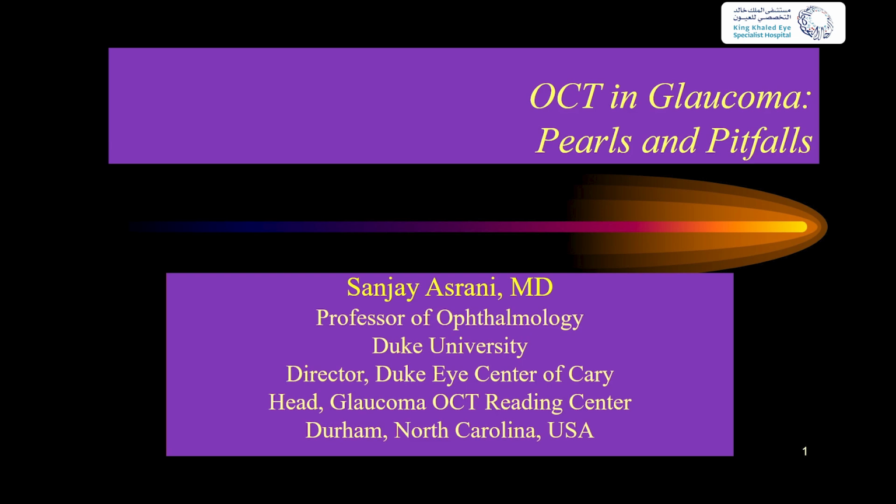Actually, I wrote an editorial in JAMA Ophthalmology last year on which OCT parameter, if any, allows us to monitor glaucoma in myopia. As I showed you in that myope, you can see the nerve fiber layer thickness in the supero and inferotemporal region, even if it is shifted towards the temporal region, because all the bundles of high myopes are shifted towards the fovea. So the normative database is going to come out wrong. So you have to completely ignore that and actually look at the thicknesses supero and inferotemporally.